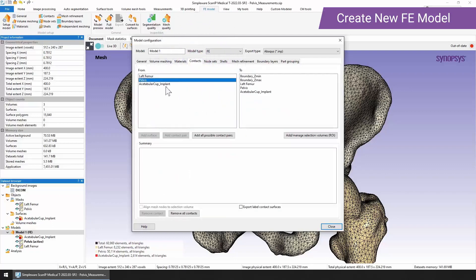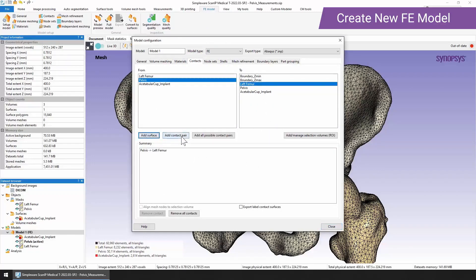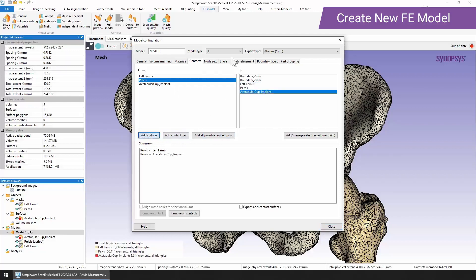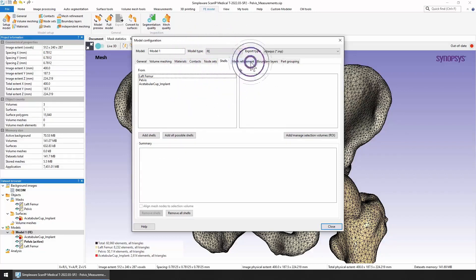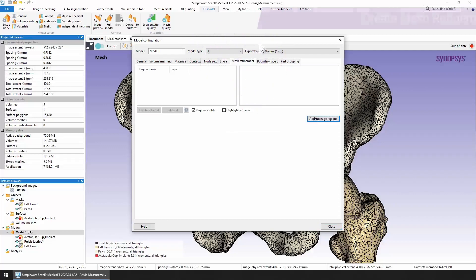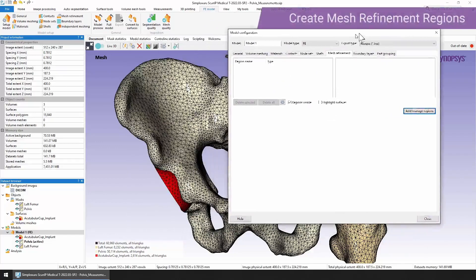You can also set up contacts. For example, we might have a contact between the pelvis and the left femur. We can add a surface or a contact pair, and we could do the same for the acetabular cup as well. We can also add node sets, shells, mesh refinement regions.